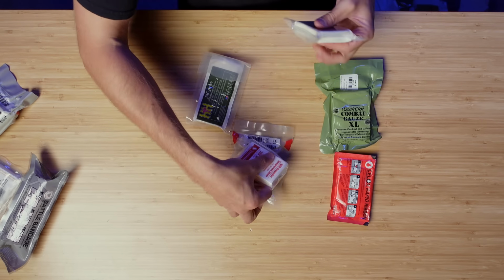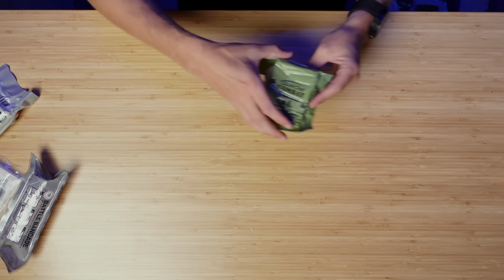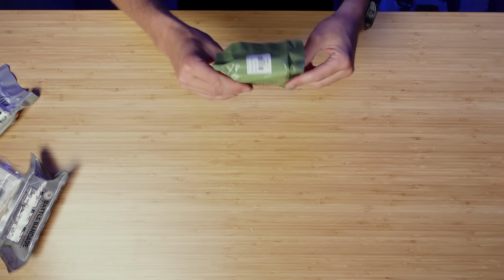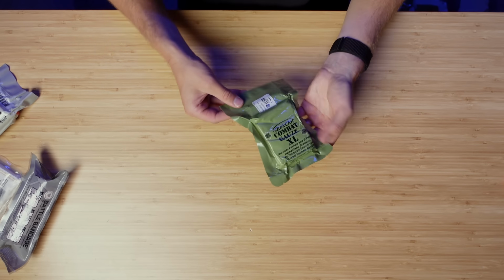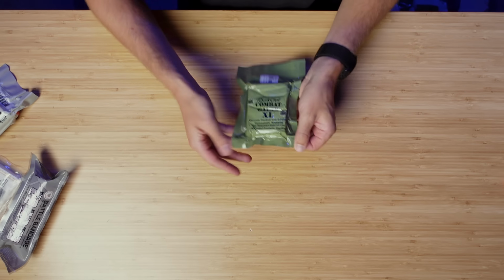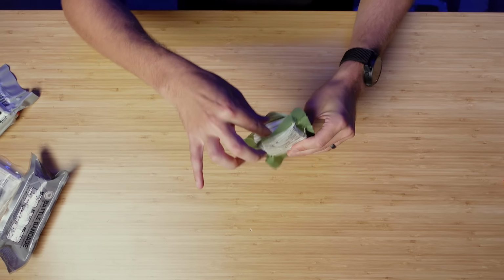So let's start with the most commonly known product here, and that's going to be QuikClot Combat Gauze. Now, this is the XL version. I don't even know if they make that anymore, but this is your gold standard. Now, the packaging here, we've got a couple different serrations to help you open it. You got two on the sides, and then you have four on the bottom, and you can open this with any of them. So you just tear it. It's going to come out relatively easily.